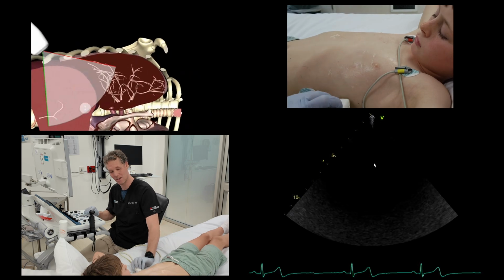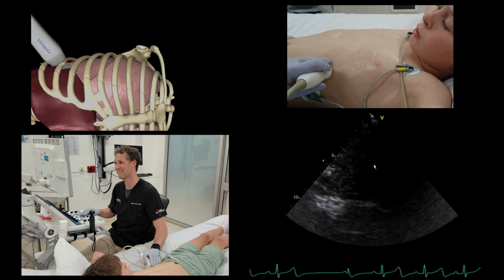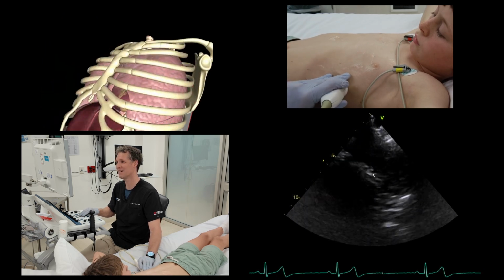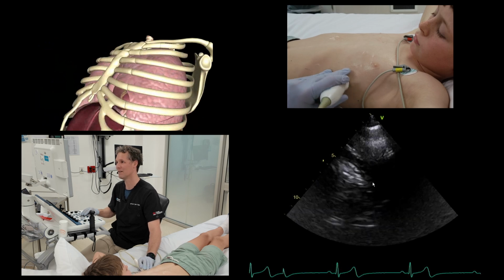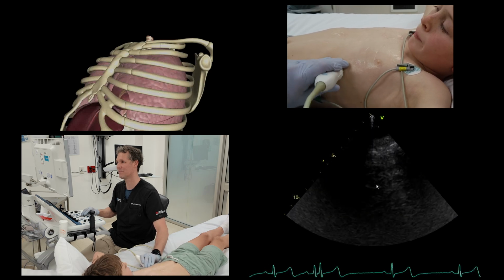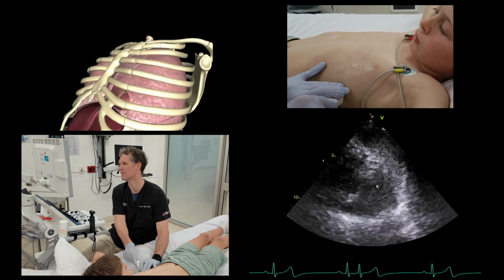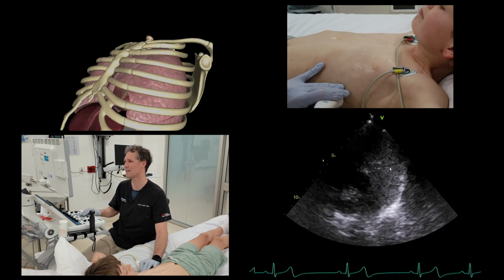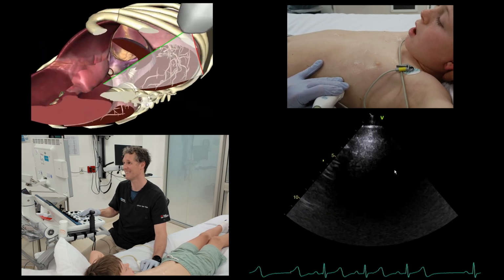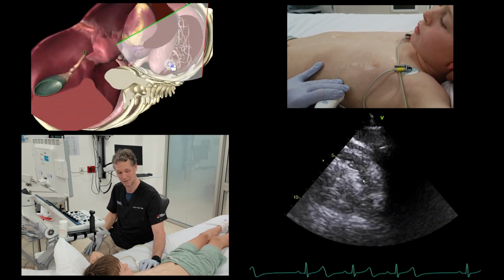We can see that on the other side with the spleen. Breathe out all the way. That's a good boy. So there's the spleen, there's a kidney. See if I can find the bright line of the diaphragm. So I'll just breathe away normally. So here's the spleen on the left side. There's the spleen, there's the diaphragm. And again, you take a deep breath in for me, buddy. And there's the dirty shadow of the lung that comes in, called the lung curtain sign.